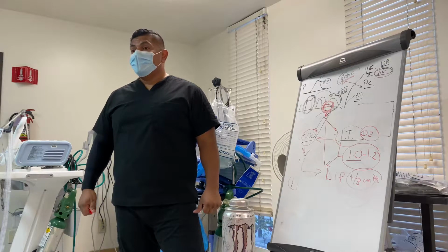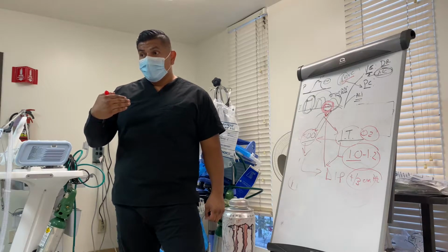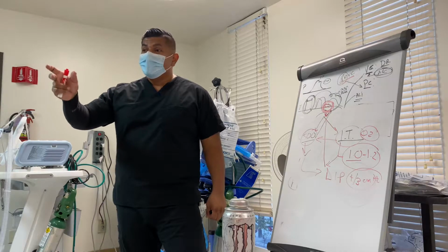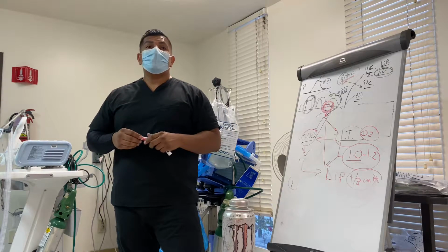What it sounds like you're trying to tell me is that you're trying to keep up with the patient. Right. So if the patient is tachypnic, you're chasing that demon. So you are not fixing the underlying cause. Okay. That is the problem.